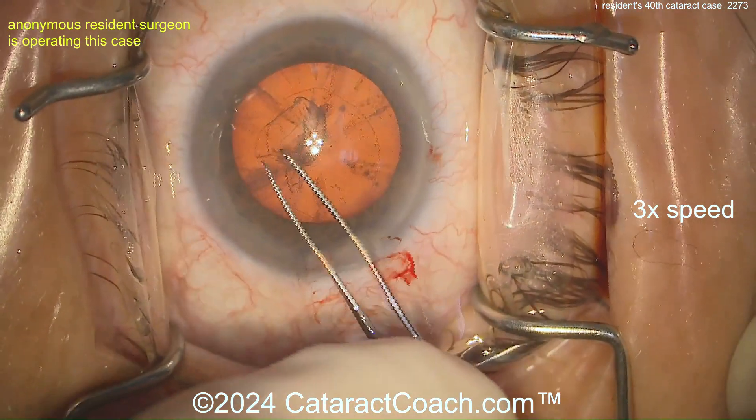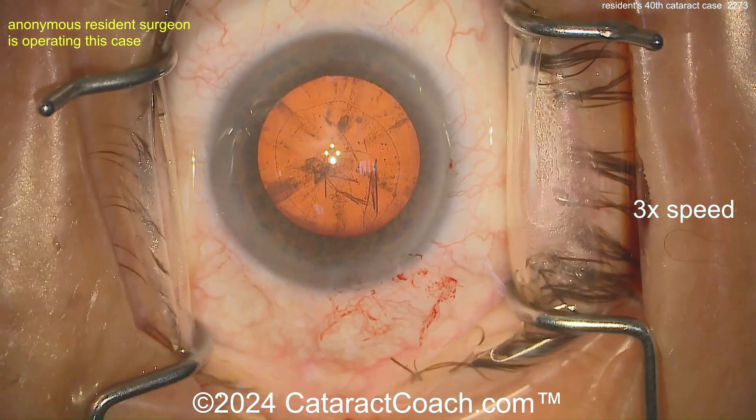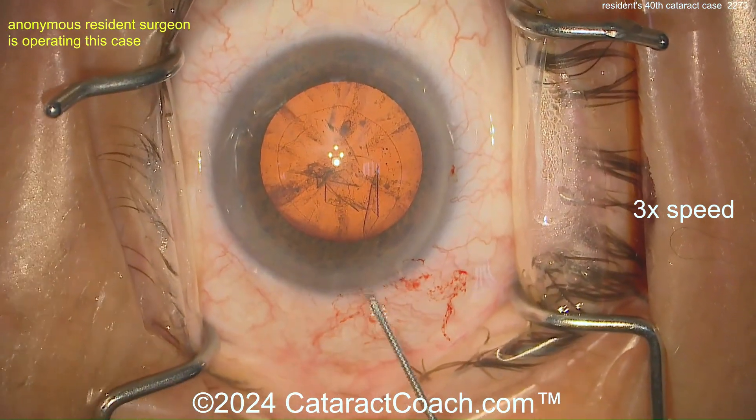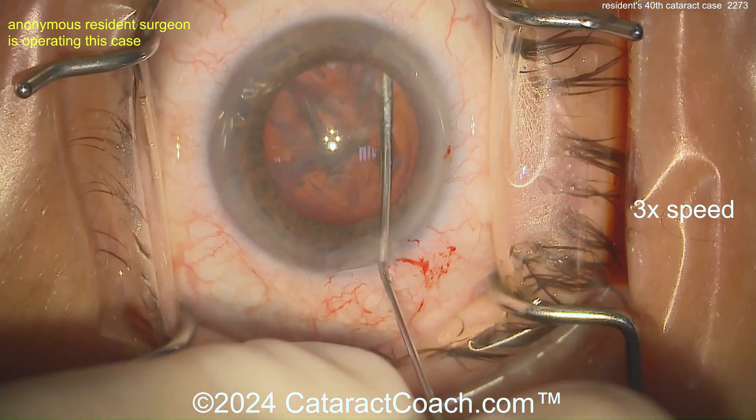The rhexis size looks good at first, but now look — finishing up a lot smaller. That's a little bit of a small rhexis for me. Sub-incisionally I like the rhexis size superiorly, but the other parts I don't like as much.